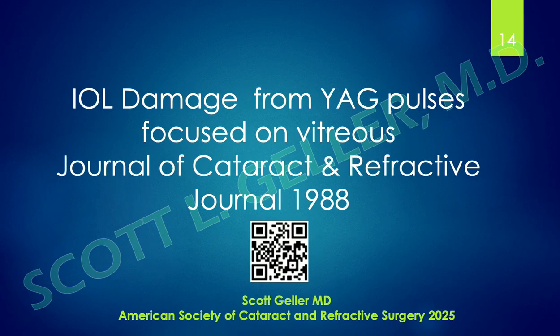There was an article on IOL damage, intraocular lens damage, I should say, from YAG pulses focused on the vitreous. This was in the Journal of Cataract and Refractive Surgery, 1988. You can scan the QR code to see that.